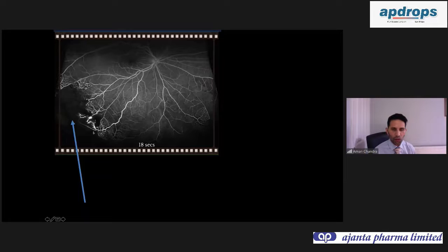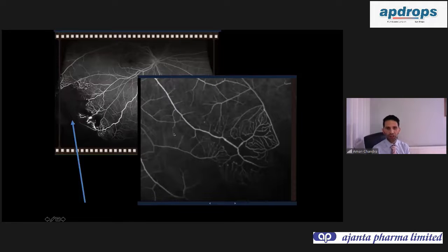But with one-shot wide-field angiography, and in this case, ultra-widefield, you can actually see here on the nasal side, there's also some changes that might direct you to apply more treatment in both areas. So this is very useful because you've seen here that there may be more than one area affected, which you may not have highlighted just with a normal fluorescein angiography.